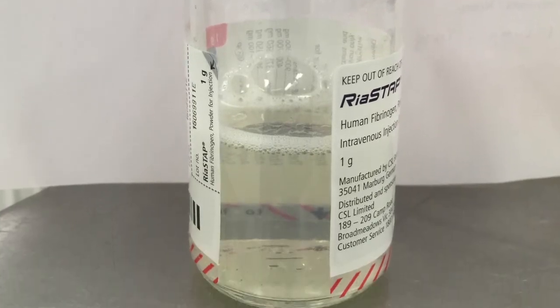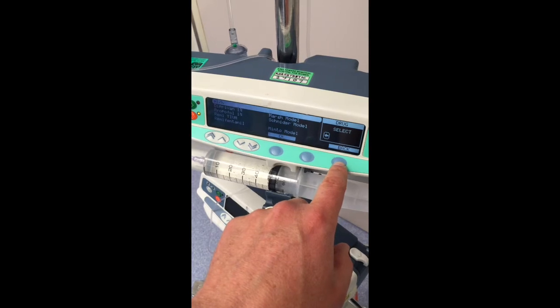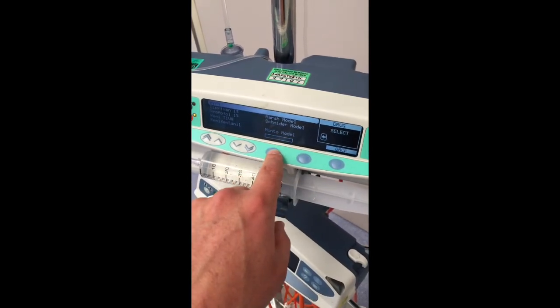Carefully draw each 50ml of dissolved fibrinogen solution into a standard 50ml syringe, being careful to expel any foam or air.